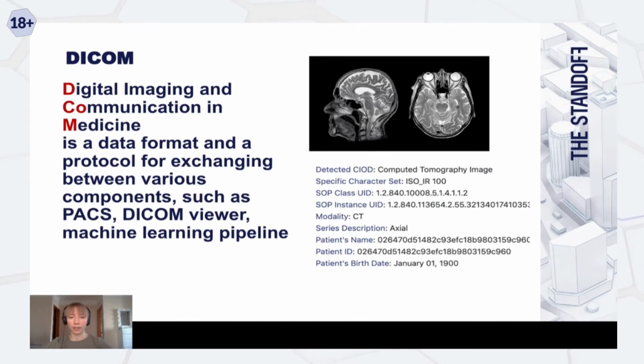So what's DICOM? Digital Imaging and Communications in Medicine. This is a protocol with two parts. First of all, it is for exchanging files between various components.